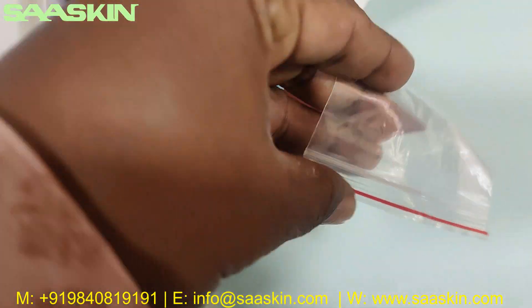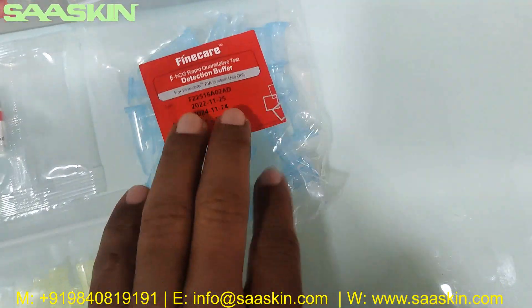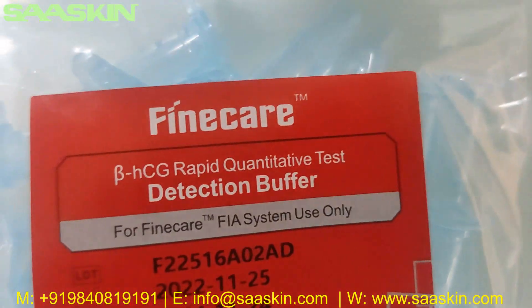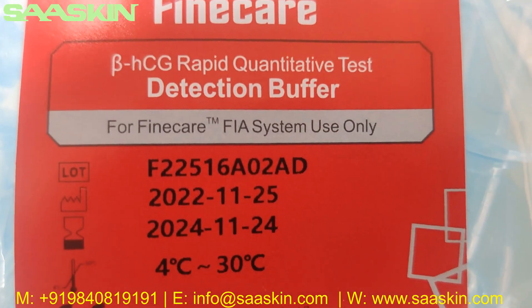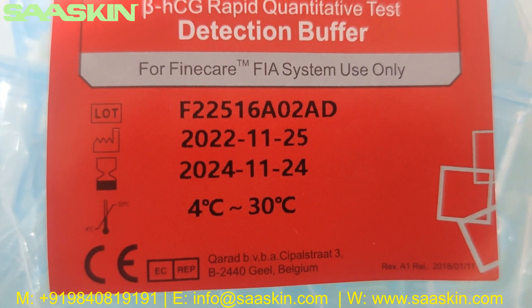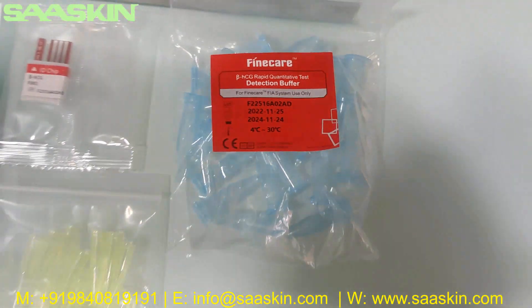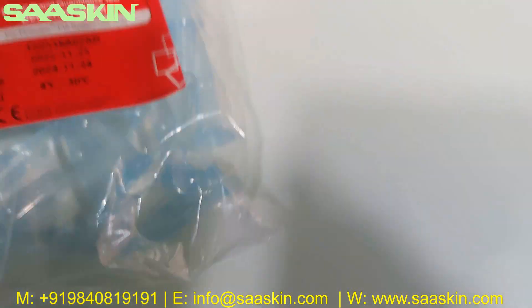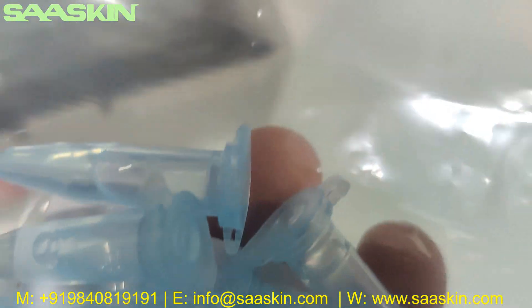There are 25 pieces of detection buffer. Beta HCG Rapid Quantitative Test detection buffer for Fine Care systems. The lot number, the expiry period, and you get the temperature range. It's a bluish color and you can see the buffered liquid is there — individually packed buffered liquid.